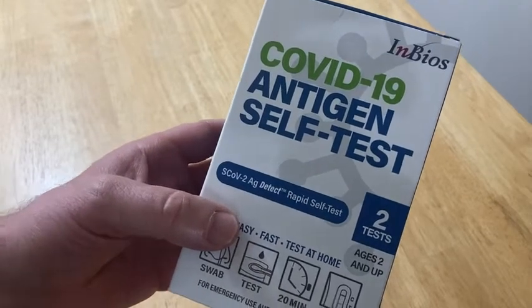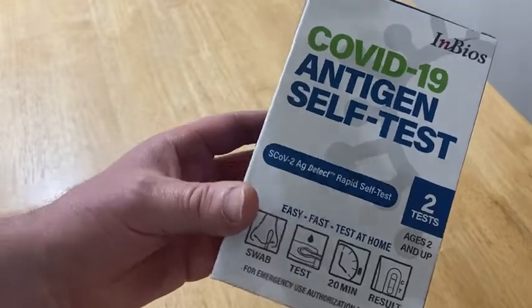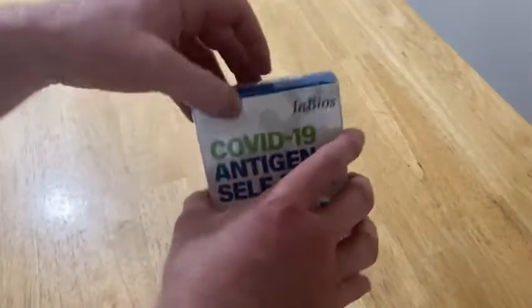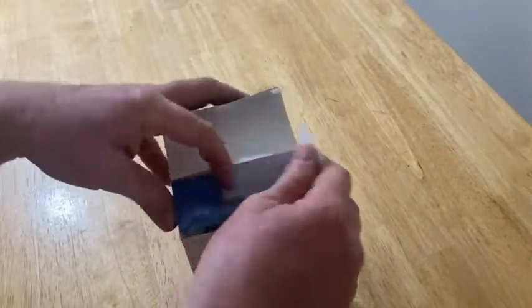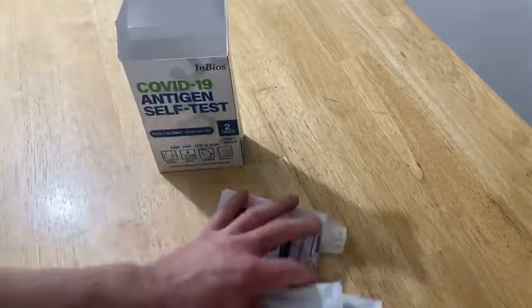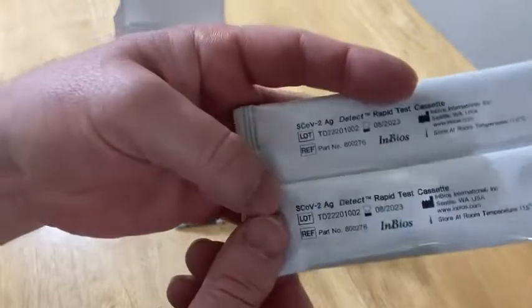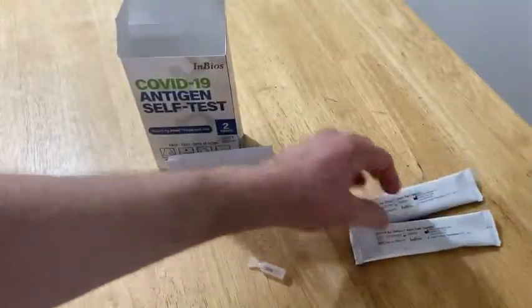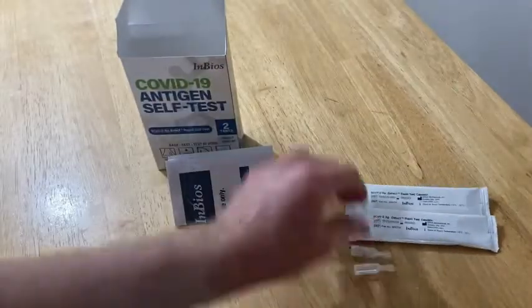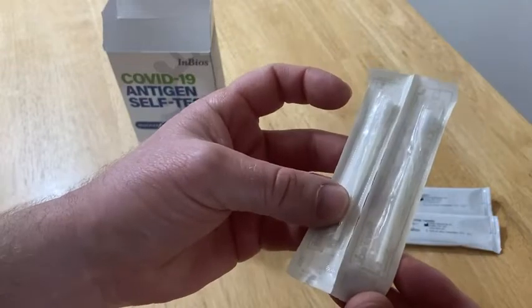In this video we're going to be looking at these COVID-19 antigen self-tests. You get two in this package. Let's go ahead and open it up and take a look at everything that's inside. You get two of these, one for each test, two little dropper things, again one for each test, and then two swabs, one for each test.